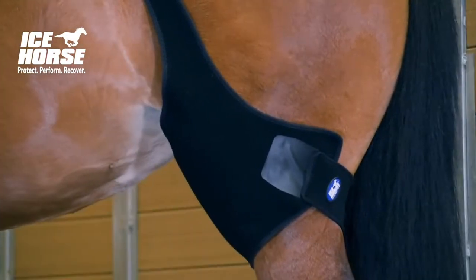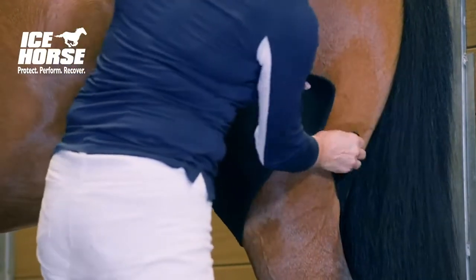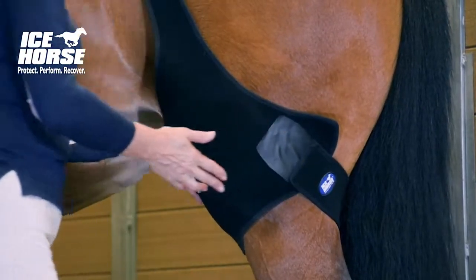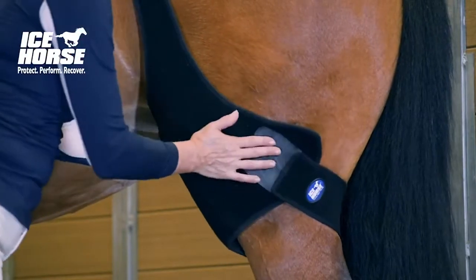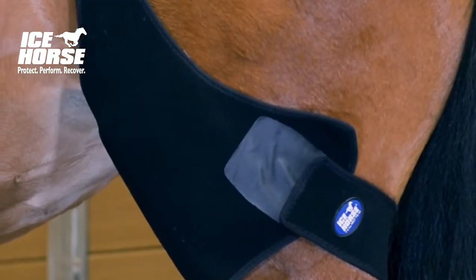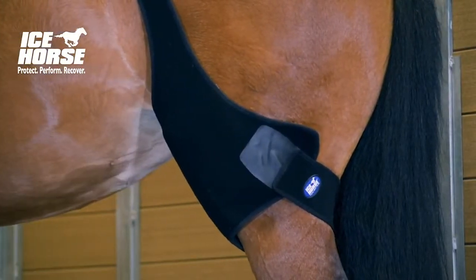Repeat the process on the other side. Once you have the wrap fastened securely on both legs, come back to the original side and adjust the wrap. You may need to pull it up a little higher and readjust the strap over the horse's back, and you may need to tighten it a little more. Don't worry if you have to go back and forth several times. The important thing is to get a nice tight compressive fit of the ice against the horse's stifle.